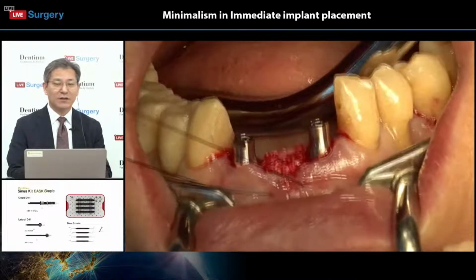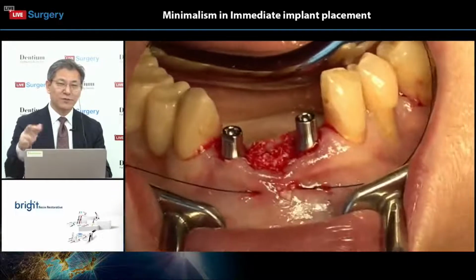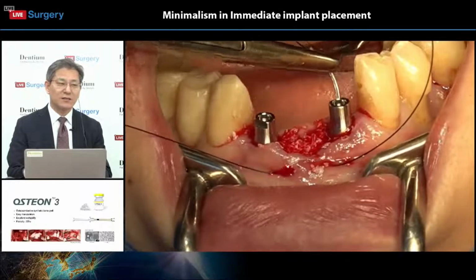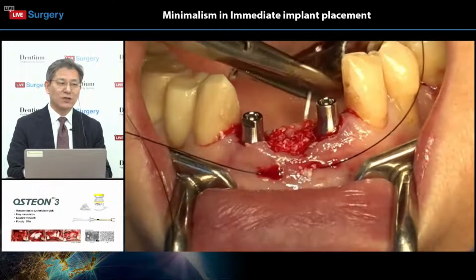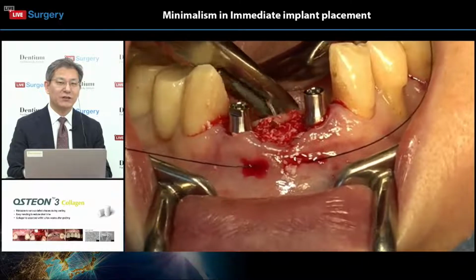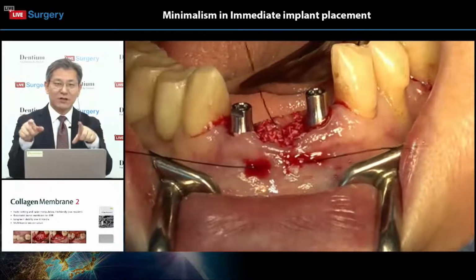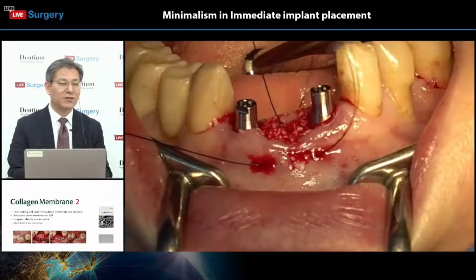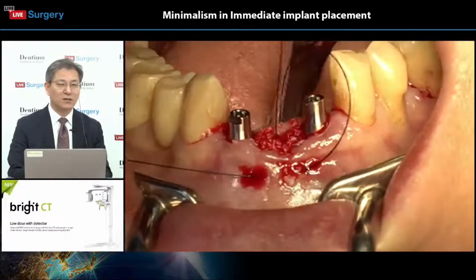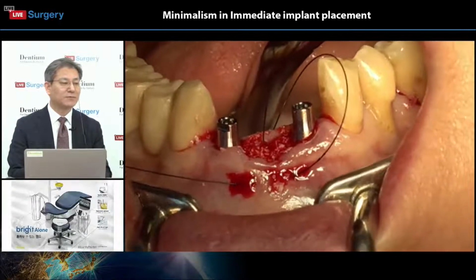Sometimes we flip the position of installation. Instead of the lateral incisor, we can install the implant fixture in the central incisor area, right? So 2 central incisor implants with a cantilever, and finally 4 units of final restoration with zirconia, is also another way to restore the lower anterior.